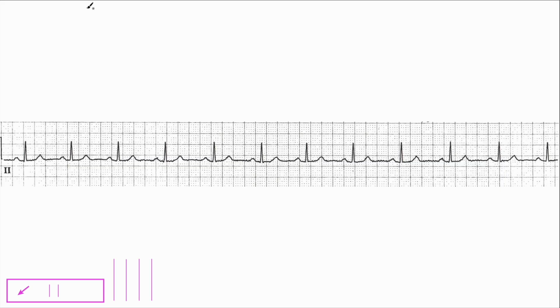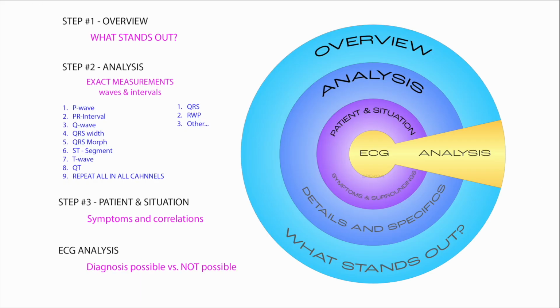So before we get into the actual ECG interpretation, I do want to show you the method that we're using. A method is something that you will have to develop on your own. Well, you don't necessarily have to develop it, but it certainly helps quite a bit. And this is what we use at Pekga, something that we have built up over the years, if you will. Our method consists of 3 steps.